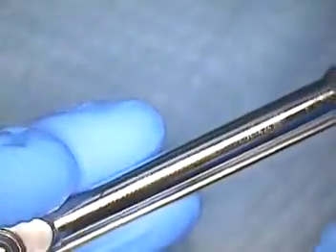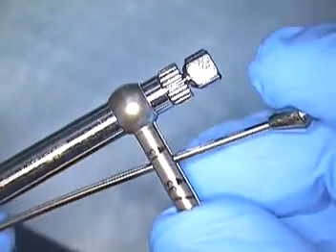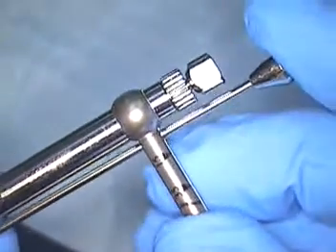So this happens to be Nobel's, which was Branemark. So right about here would be 20, right about here would be 30. So back in the mouth to check Larry's case.